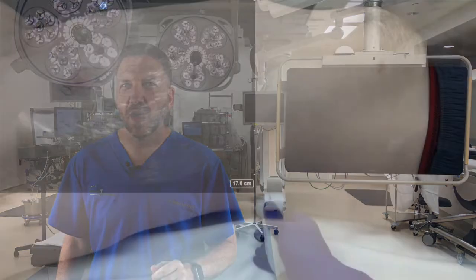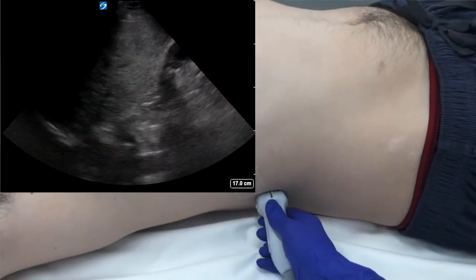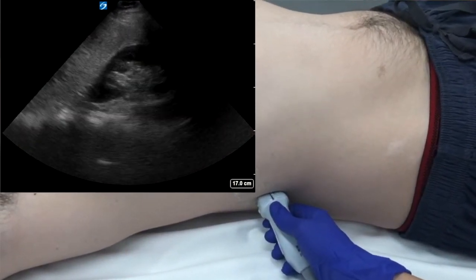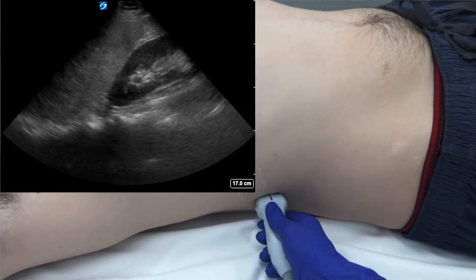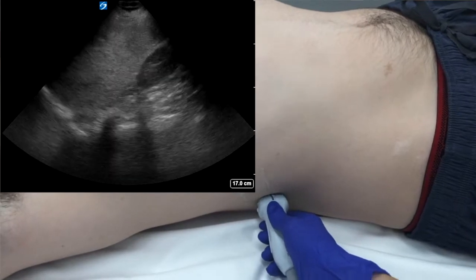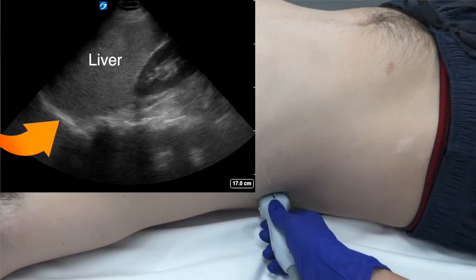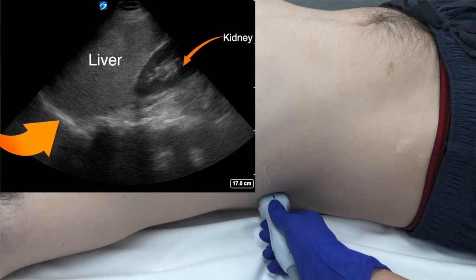The right upper quadrant is viewed with the probe placed to the low right costophrenic margin and oriented vertically with the marker pointed superior. The examiner should dynamically view the diaphragm, liver, and right kidney.